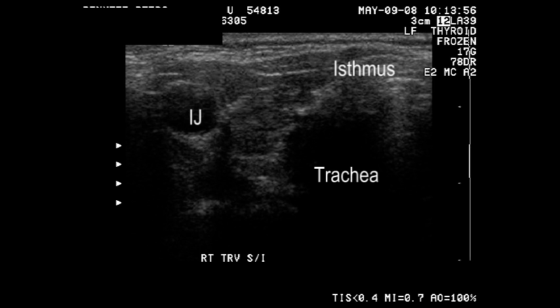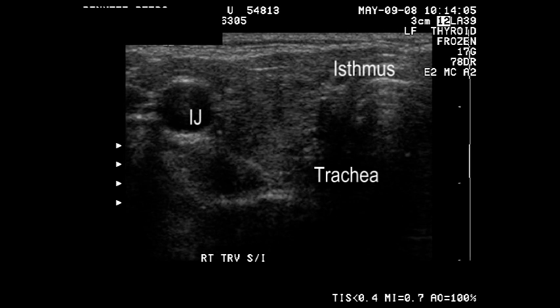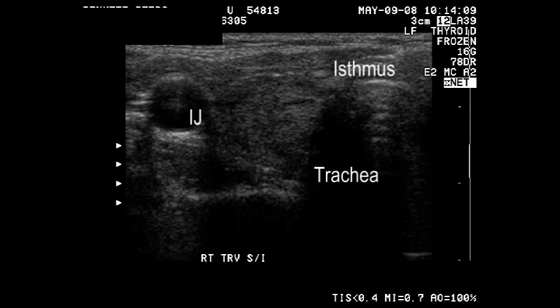Once again, we orient ourselves by finding the trachea and a vessel — in this case the internal jugular vein. We can also clearly see the isthmus of the gland.